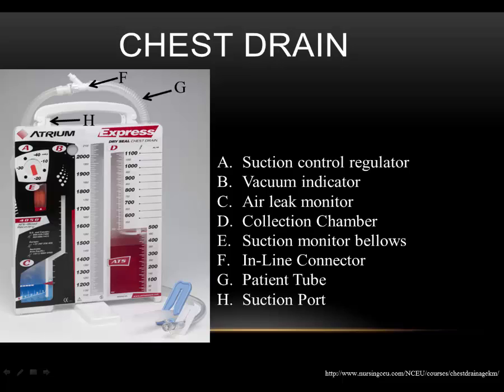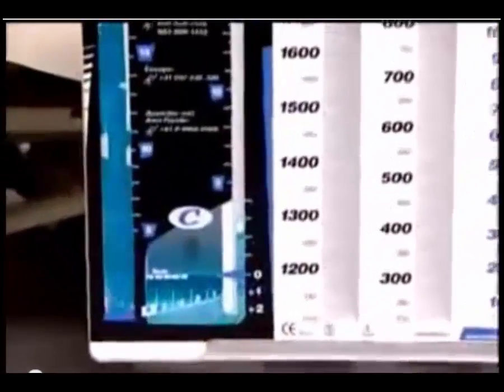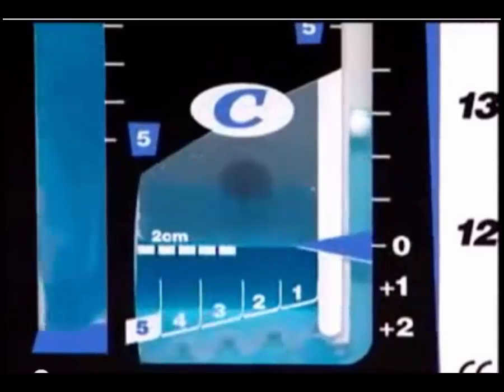On the other hand, a mechanical dry seal valve does not provide the same level of patient diagnostics as a traditional calibrated water seal. Dry seal drains must rely on other means to provide diagnostic information, such as a separate air leak monitor for optional air leak detection, and a vacuum indicator to determine when vacuum is present in the collection chamber. A water seal is a simple one-way valve, which allows air to exit the chest and prevents air from returning to the patient under normal conditions.